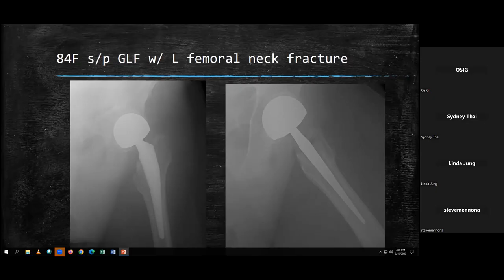Yeah, so with cement, some of the things that change is that you're no longer relying on that press fit, right? So you're relying on a bone cement implant interface, and so you mix the cement intraoperatively. You place it into the canal. Usually there's some sort of what we call a restrictor, something that will stop the cement from just continuing to go down the canal, and then you'll place your implant in, and one of the advantages that cement has that doing a press fit doesn't is that you can change the angle of the femoral head or the implant as you place it intraoperatively.